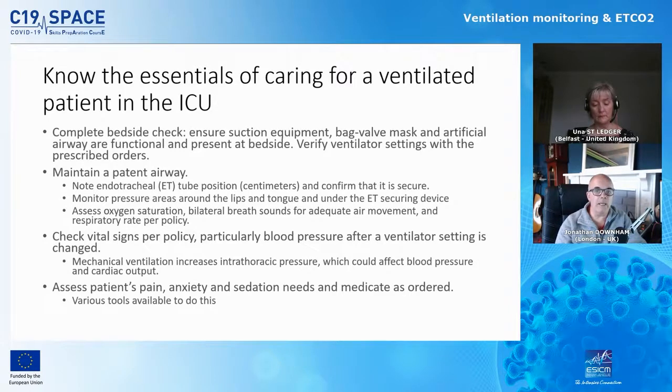And again, like I say, under the ET securing device. So have a look under there. If it's wet, if it's blood stained, if it's got secretions on it, then that's something that you need to change as well.